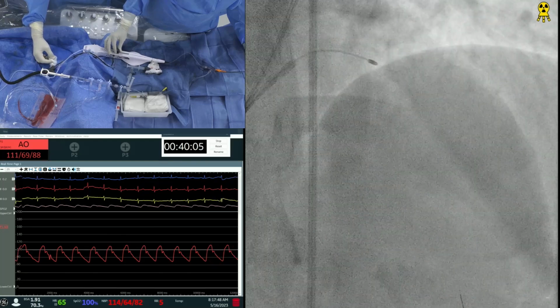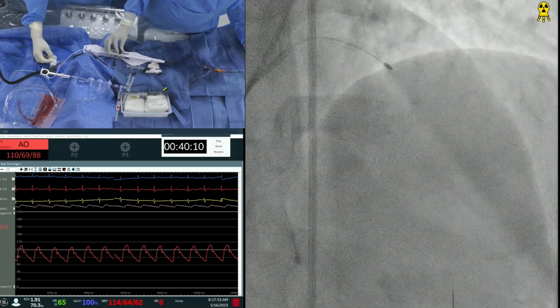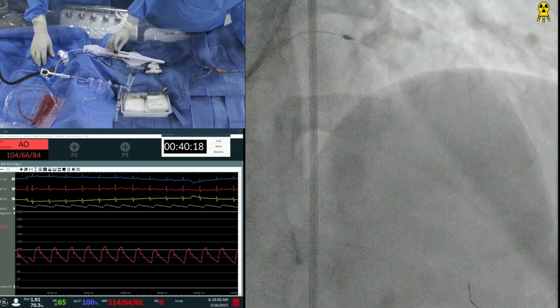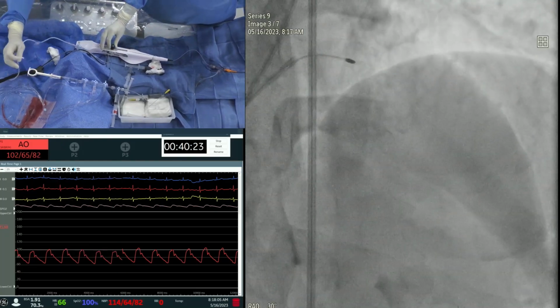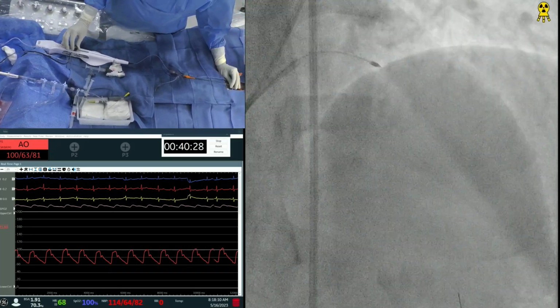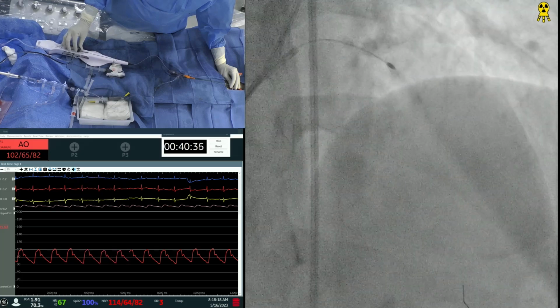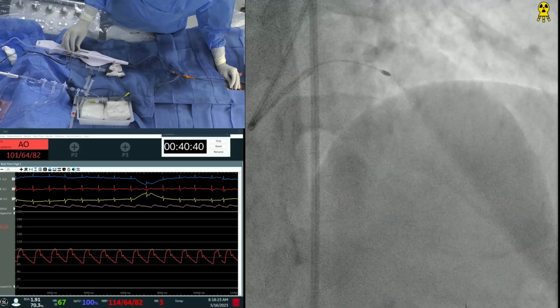Slow pecking motion. And I'm sure Dr. Kinney is going to follow it up with the polishing run as she defines it. We haven't crossed yet, but can you use orbital in this case? I think we could have used orbital also, although it is a little angulated, and we try to avoid orbital in angulated segments.